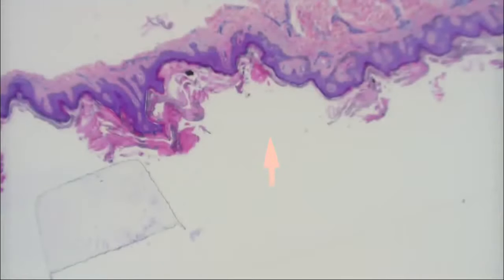It seemed to be too large to be tinea or candida, but too small to be scabies. You're talking about this kind of blackish stuff here? No, not the black stuff. It was like a golden brown, almost. Yeah, the first cut. I'm not sure if it's upside down. Oh yeah, the first cut, and then there's like this little thing in the stratum corneum.